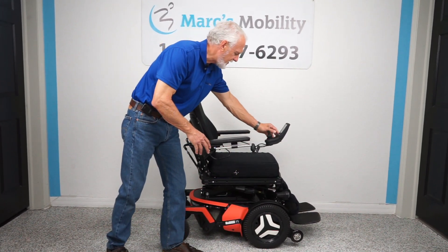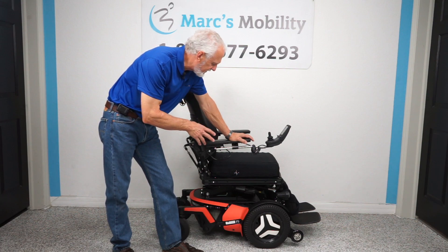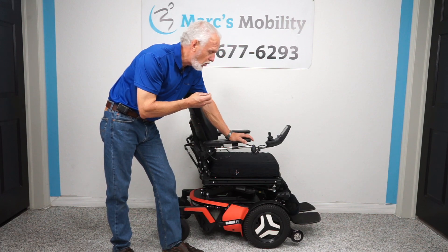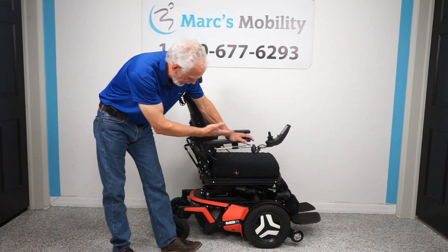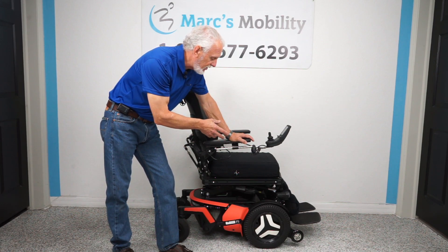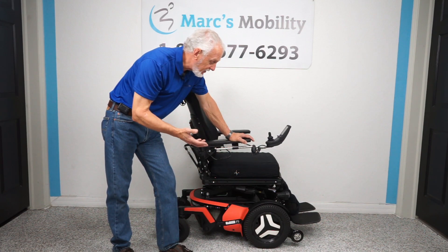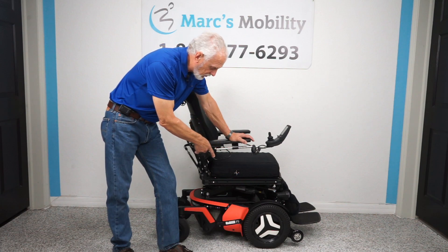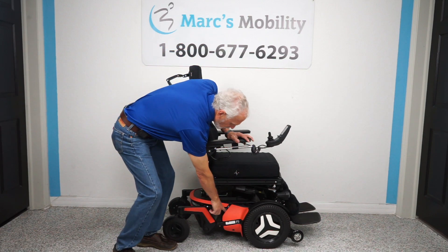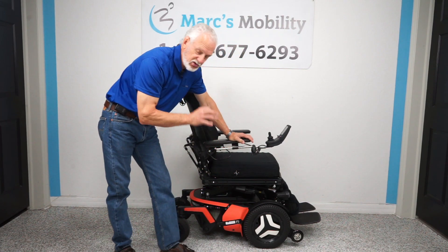Hi folks, we have a one-of-a-kind here — a Permobil F5. You don't see too many of these around. This one was sent to us and it had 415 miles on the chair, but it looked new and everything worked perfectly. We replaced the two motors — we spent $1,600 for two motors. We have the receipt so you can see what we paid. These are brand new motors, which is the most important part of the chair.